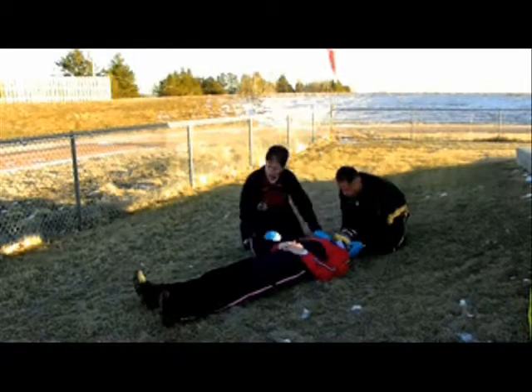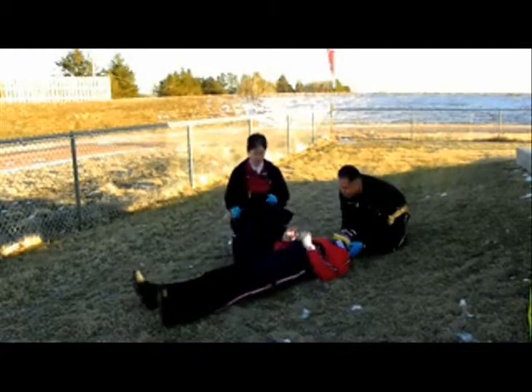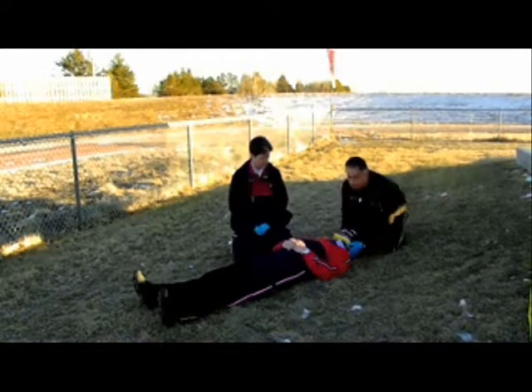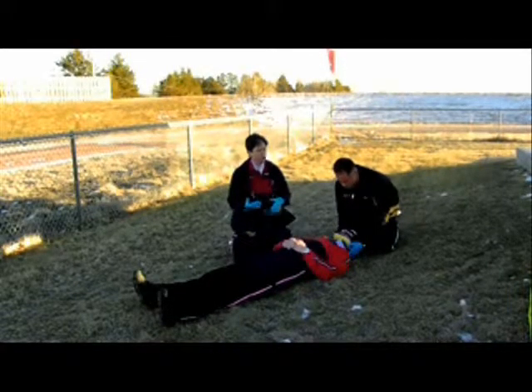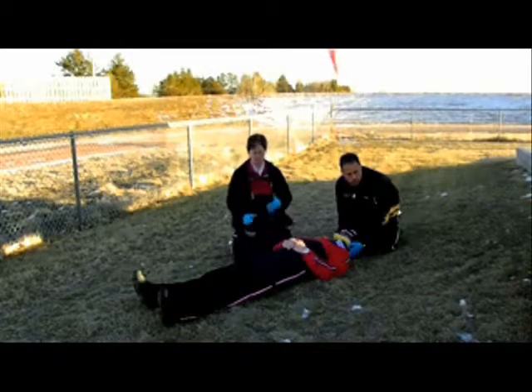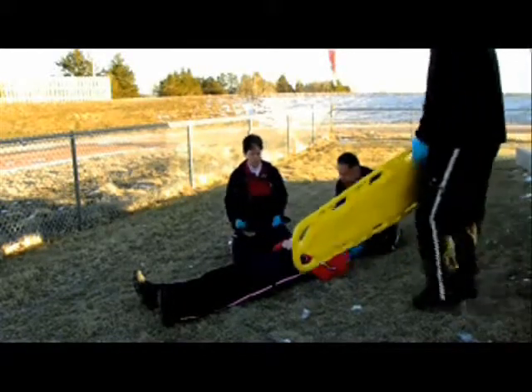How does that feel, Jason? It feels much better. I'm going to go ahead and check his distal CMS again to make sure that everything's along his baseline so I can report that to the receiver facility. At this point, we're going to go ahead and immobilize him to a backboard, and this is where we can further immobilize that cervical spine.